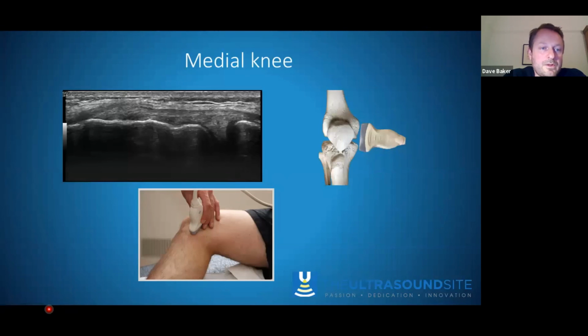So also we're seeing that little triangular wedge, if you can just hover over that, Stu, which is the medial aspect of the medial meniscus. And so oftentimes, if there has been an injury in the medial compartment, you can see evidence of some changes within the medial meniscus there.